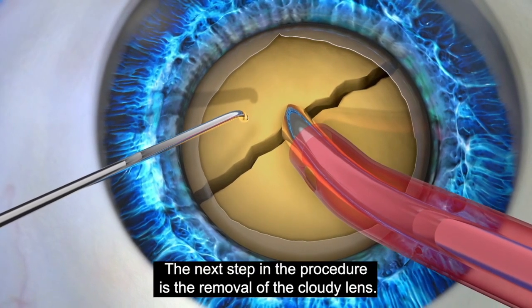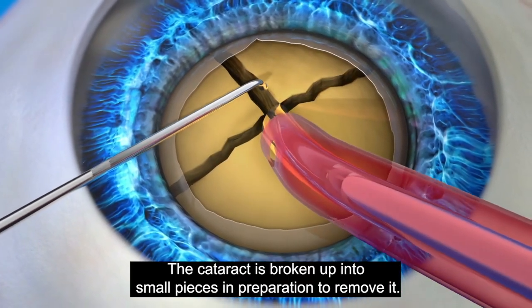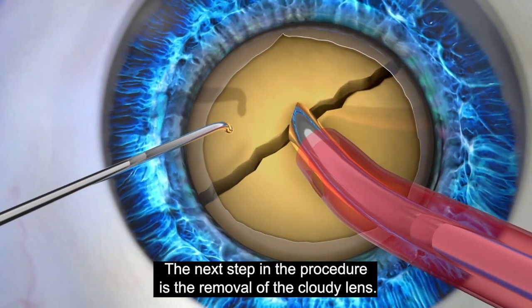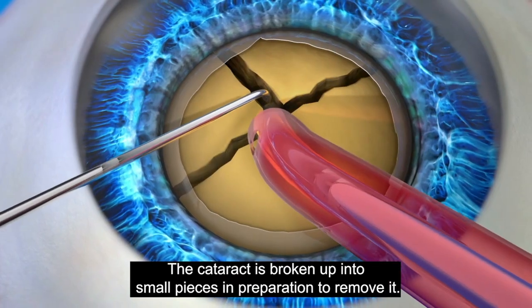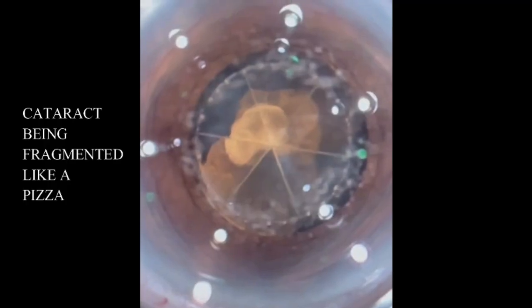The third big difference is this is how the cataract is manually broken with the help of a chopper and a phaco probe in the conventional method into 4 or 6 smaller pieces. This is a very difficult step, especially in hard cataracts.